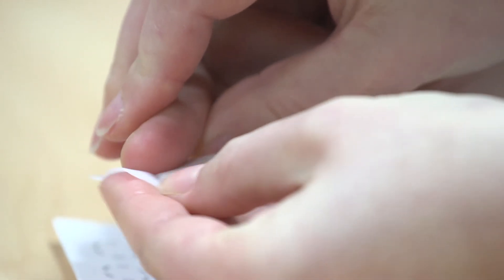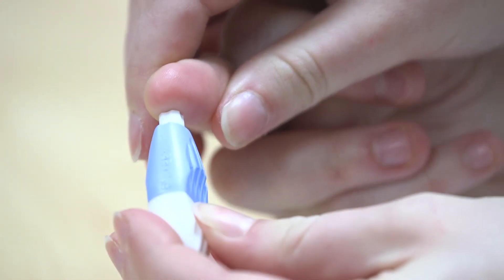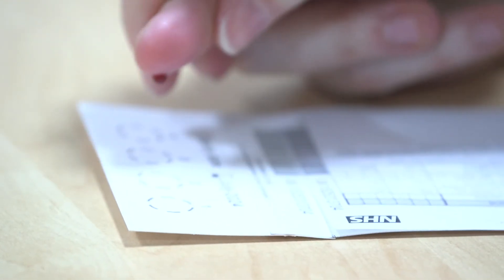Clean the heel with an alcohol wipe. Allow the heel to dry, then get the lancet and press it into the heel. Blood may appear straight away; however, if not, gently massage — but don't squeeze the heel — until the blood appears.